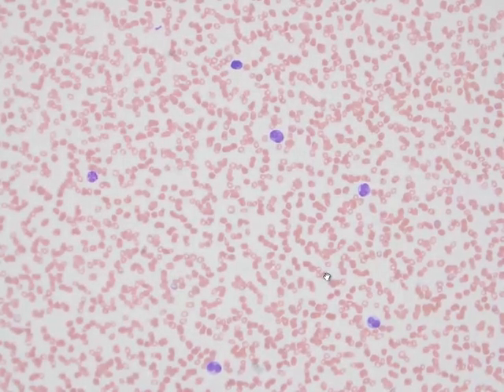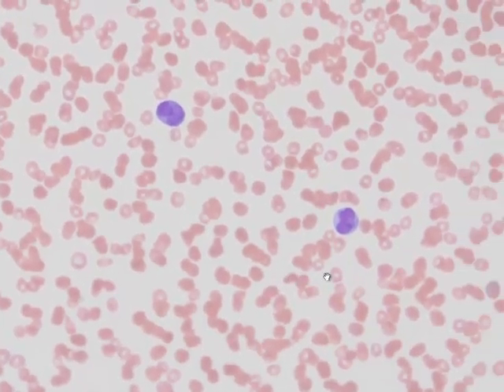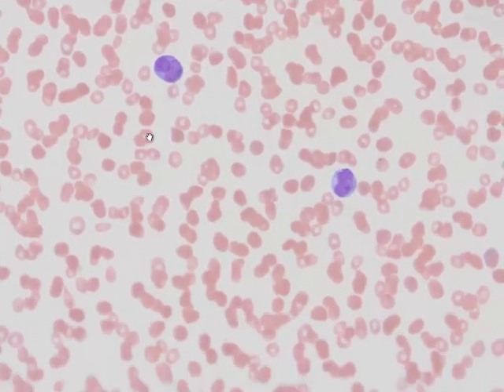Here you can see the peripheral blood smear of the patient. Before I zoom in, what we can see here is that instead of the mature blood cell elements, what we mostly see are mononuclear, immature appearing cells. When we zoom in a bit, we can see cells with blastic chromatin and kidney-shaped nuclei, or some with bilobed nuclei.